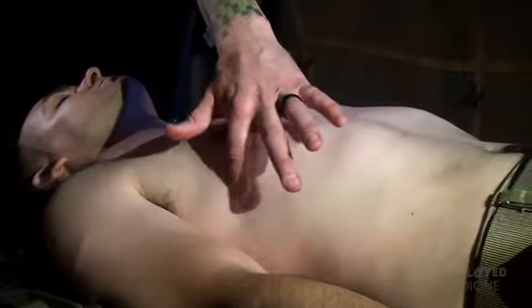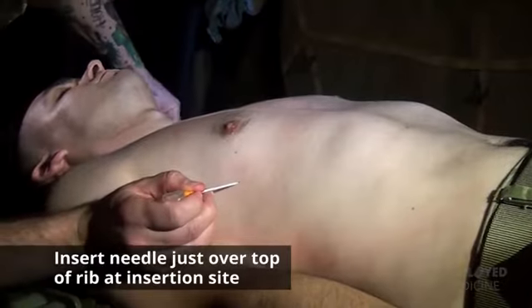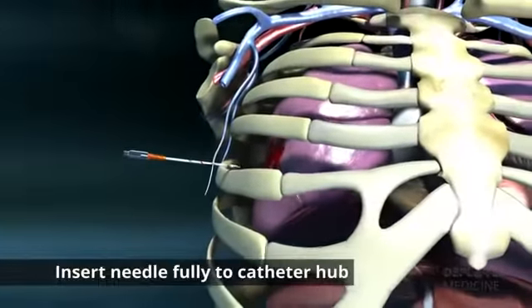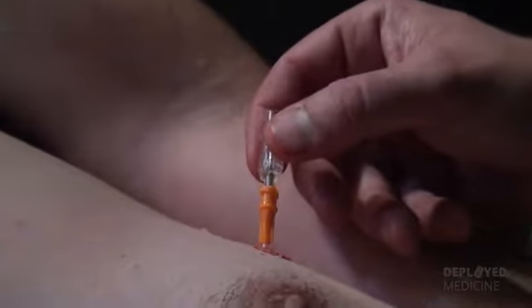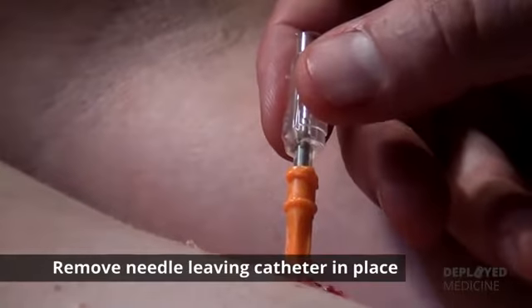Following the anterior axillary line, I'm going to insert my needle just over the top of the lower rib at the insertion site. Insert the needle catheter unit all the way to the hub and hold it in place for 5 to 10 seconds to allow decompression to occur. After the NDC has been performed, then remove the needle, leaving the catheter in place.